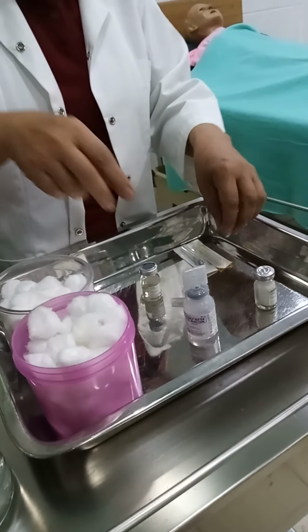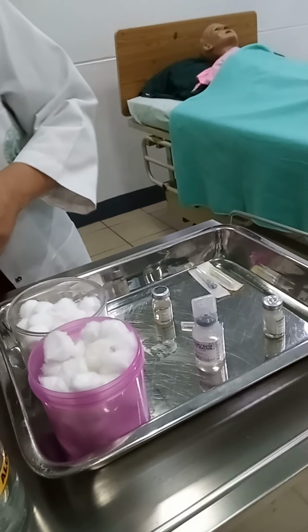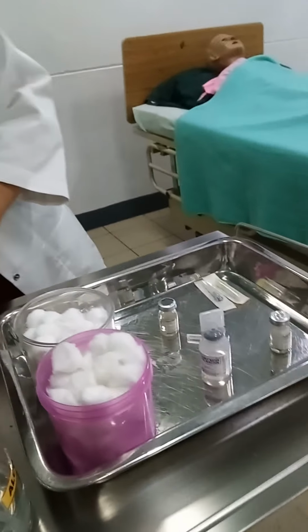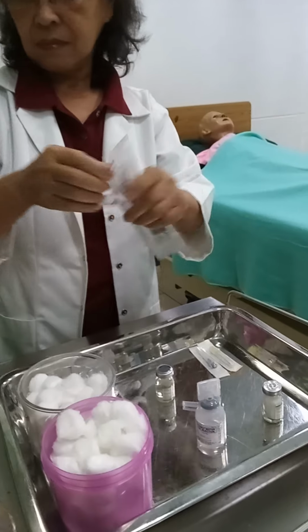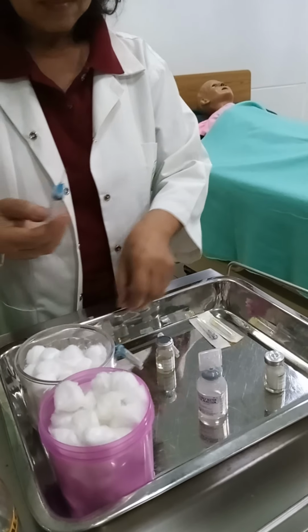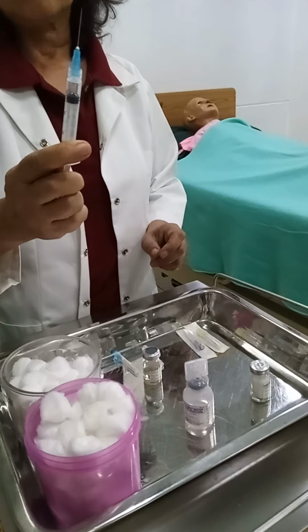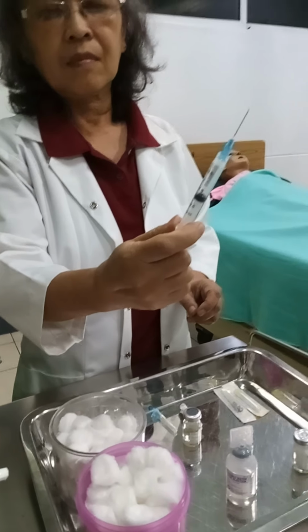Remove the needle cap from the syringe. Pull back the plunger to draw an amount of air into the syringe equivalent to the volume of medication to be aspirated from the vial.